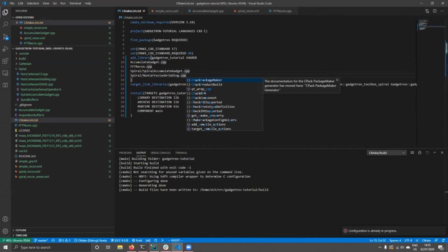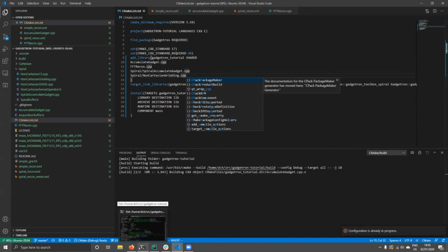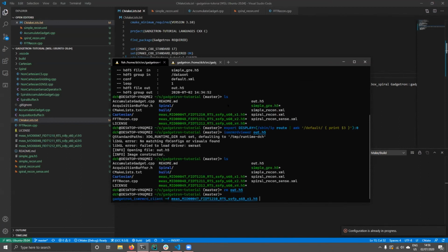Let's compile some stuff. We're building, it's fine. Let's remove old output. In case you're wondering, we don't need to restart Gadgetron, as it will reload the library every time anyway, so nothing to worry about there. We're grabbing the first file here and the spiral recon.